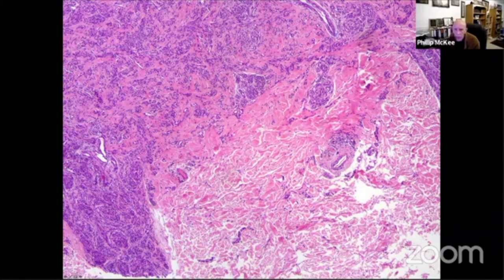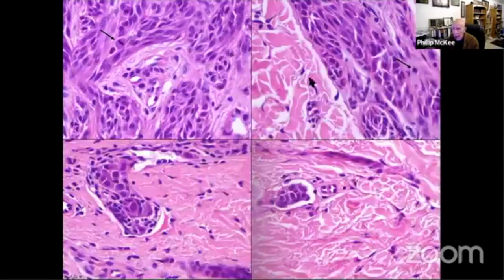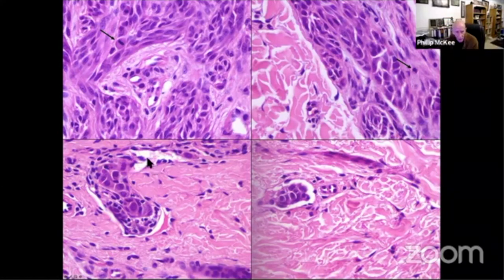But if we look at the lesion more carefully, there are an awful lot of mitotic figures present at the top in the middle. One was towards the deep aspect. The other interesting thing this lesion showed was very extensive lymphovascular invasion — it was all over the place and very dramatic.